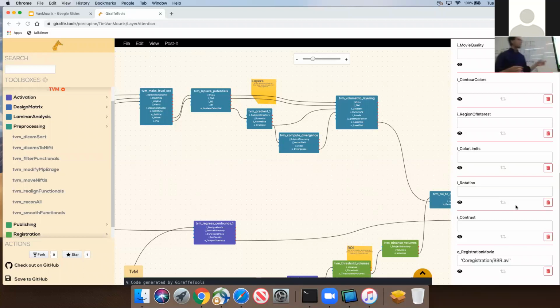What Miriam's paper did was setting up a mathematical framework of the level set method to calculate the equivolume depth. Now, what I did in my paper about the spatial GLM is the next step to make that conversion into layer-specific contribution to a voxel.